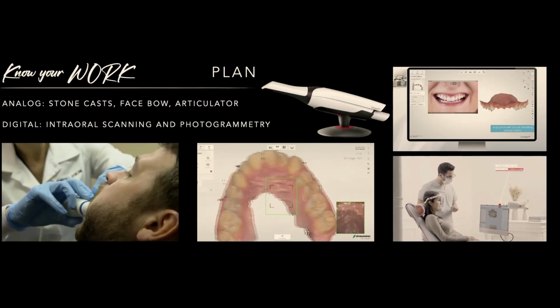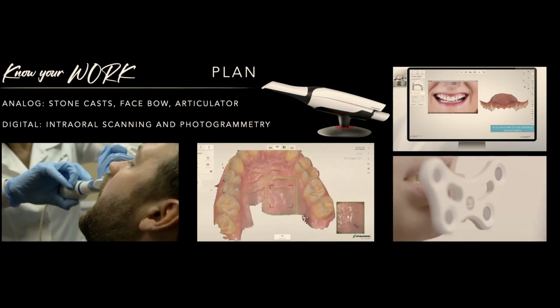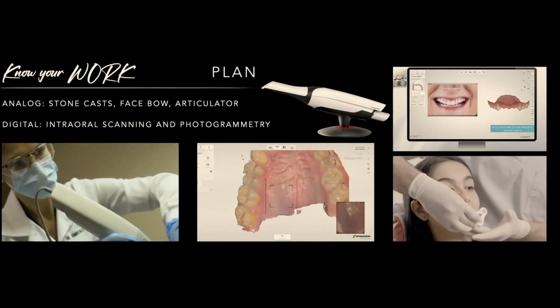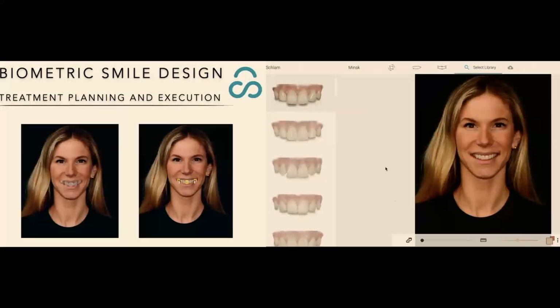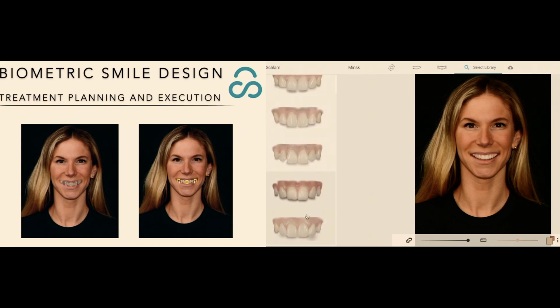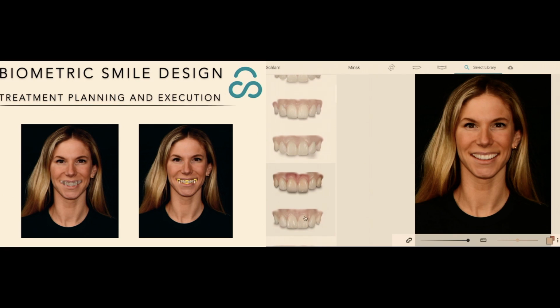This is me using a Trios intraoral scanner, and you can do some smile design, as you can see up there, using that actual scanner and design software. This is a newer smile design software that I had the privilege of playing around with when I was in Romania recently. This will be coming to the US soon. But it's a smile design software that uses a special biometric design based on the way you select it in the face. So it gives us much more realistic designs for teeth, not just this perfect Beverly Hills smile.